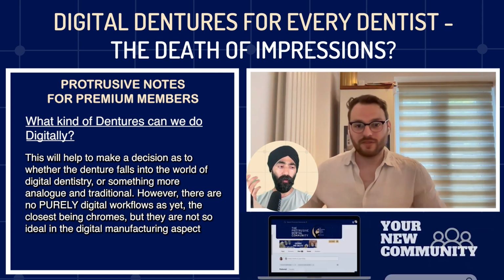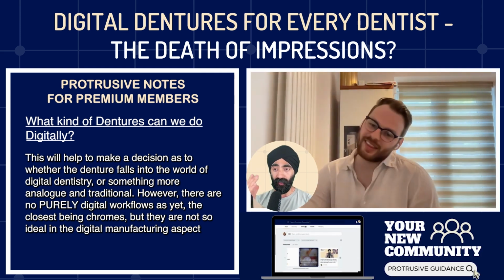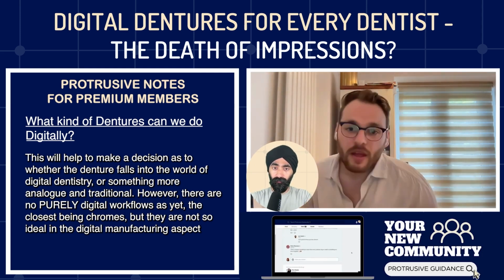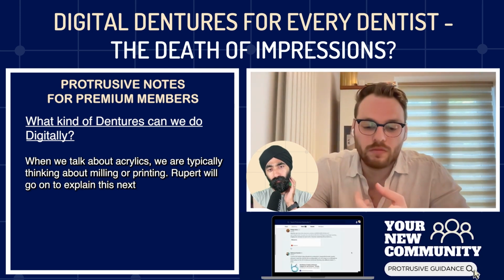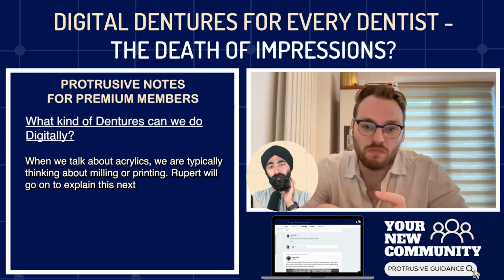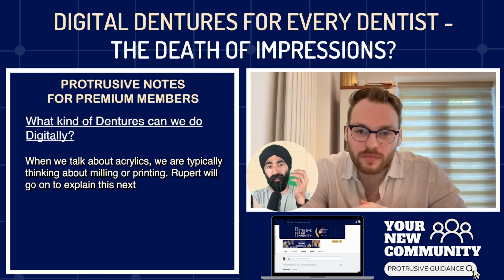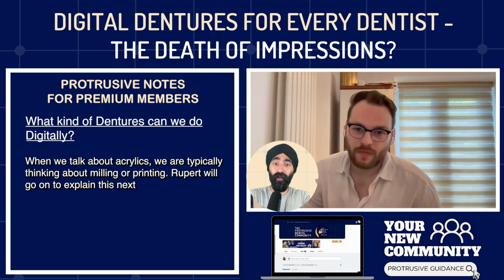Well, I guess when we were brainstorming this, Rupert, in my mind, yes, you're totally right that the whole designing is done by a technician, let's say digitally, and then there's digital techniques to actually produce the denture. Is that like printing, for example, right? Absolutely, yes. In terms of manufacture, if you're talking acrylics, you essentially are looking at milling or printing. And for dental students, can you just explain what's the difference between milling and printing, just the bare foundation, which is useful knowledge, even for how zirconia crowns are milled. What does that actually mean?